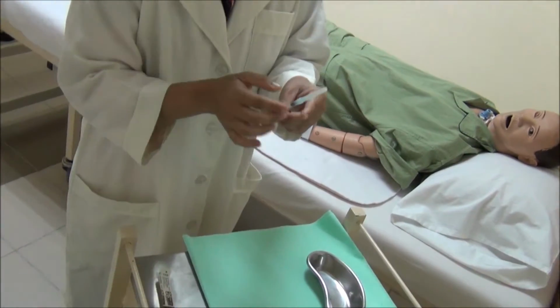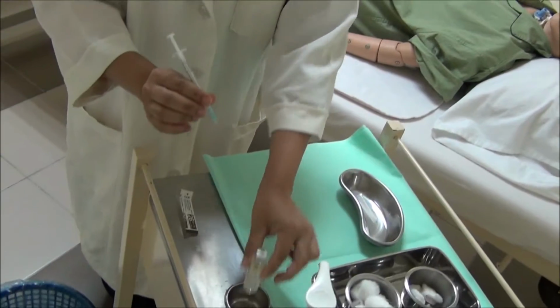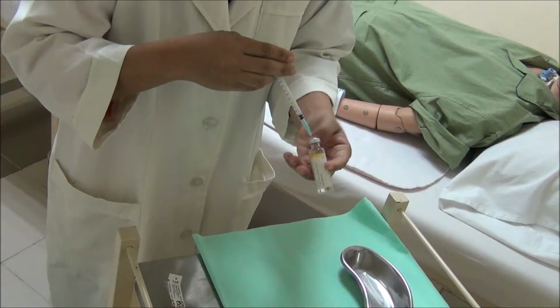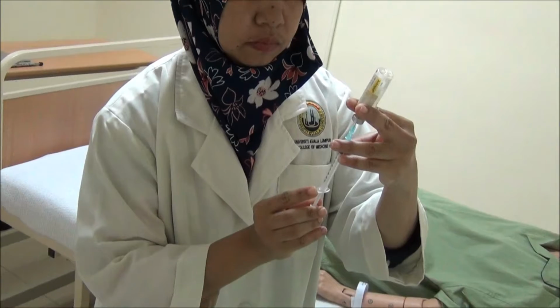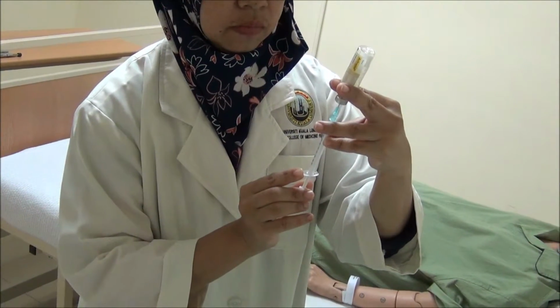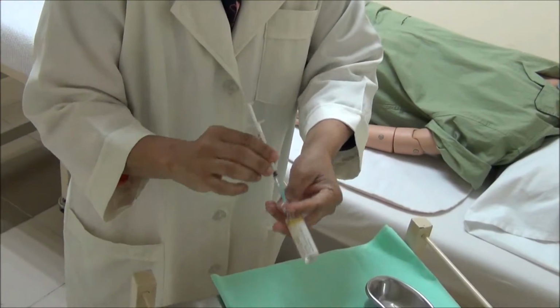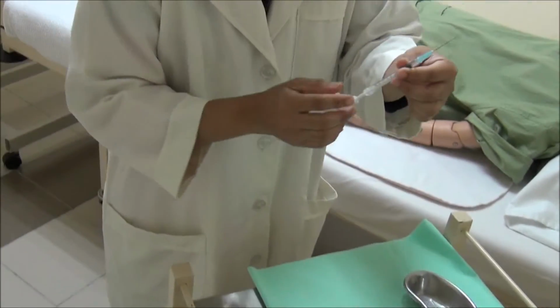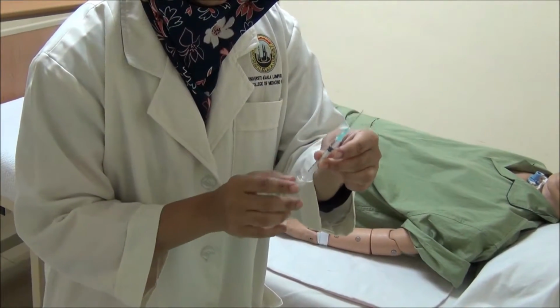Remove needle cap and draw an amount of air equal to the volume of medication prescribed. Inject the air and tilt the vial and ensure that the needle is below the level of the medication. Withdraw the required amount of the medication by holding the syringe and vial vertically at eye level.